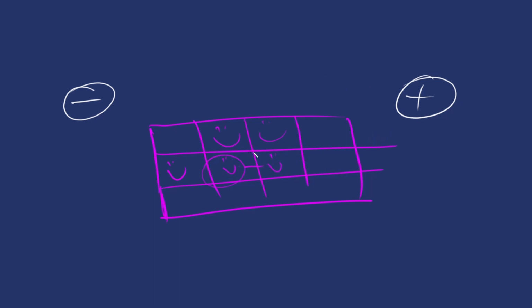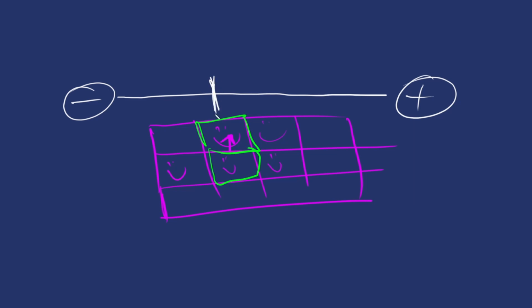Now, let's say instead, he's sending that signal upwards, right? He's sending it to that guy. If he's going here to here, on this x-plane, right, just between here and here, for the sake of this, there's no movement. Okay, there's no left or right movement. It's going up and down. So in this case, the signal that's going to come through it is nothing, because there's no left or right movement.